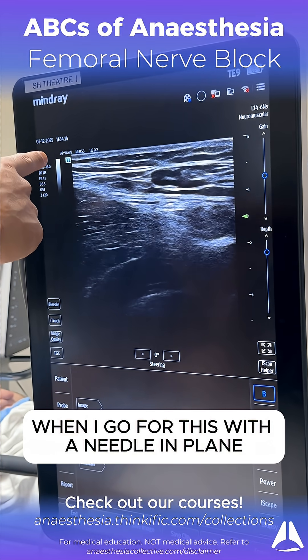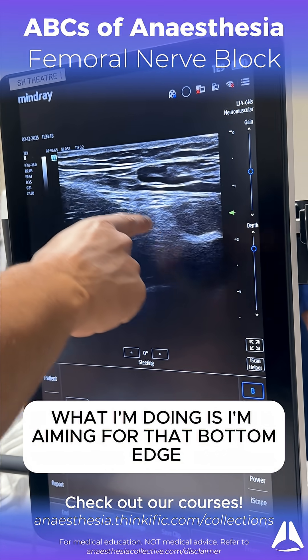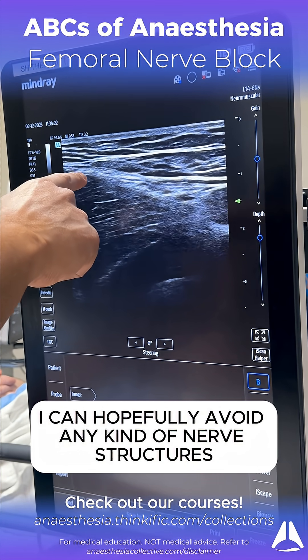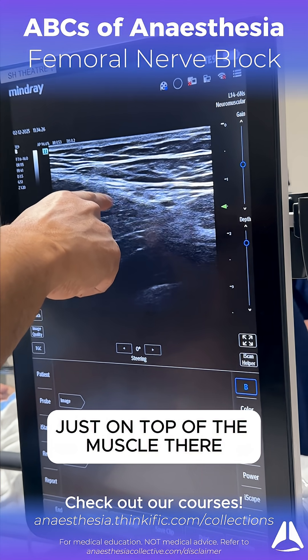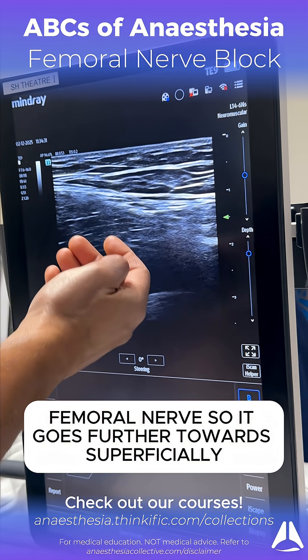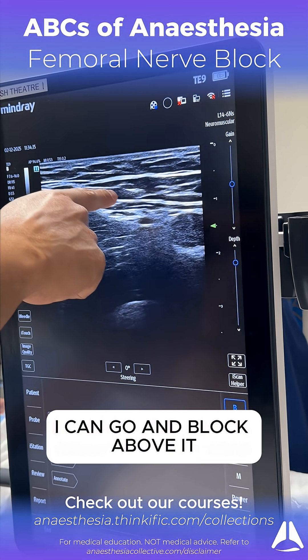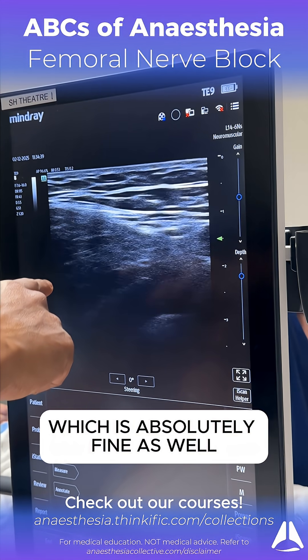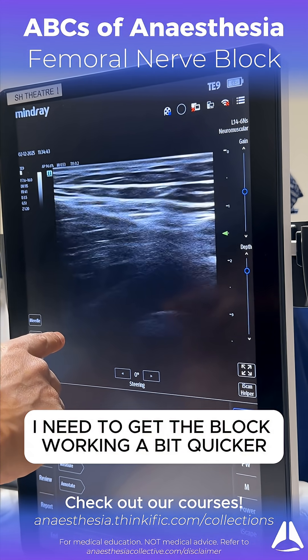When I go for this with a needle in plane, what I'm doing is I'm aiming for that bottom edge just on top of the muscle. And that way it can hopefully avoid any kind of nerve structures. As I infiltrate just on top of the muscle there, I can lift the femoral nerve so that it goes further superficially. And then my next point of entry, I can go and block above it. Some people just do one injection, which is absolutely fine as well, but sometimes I need to get the block working a bit quicker, so that's why I do that.